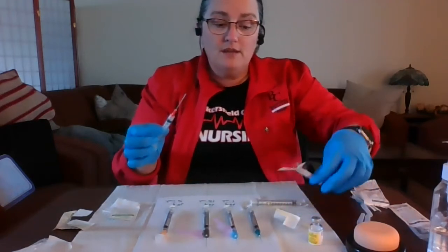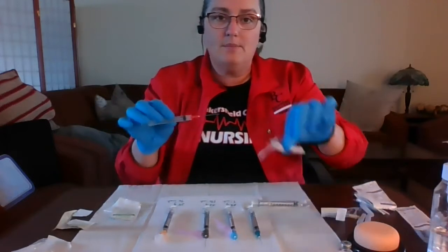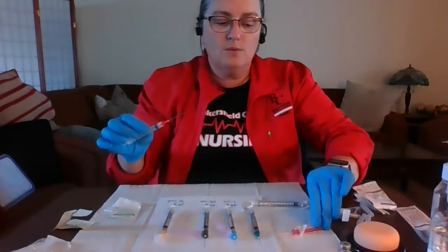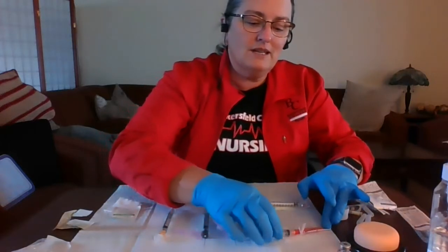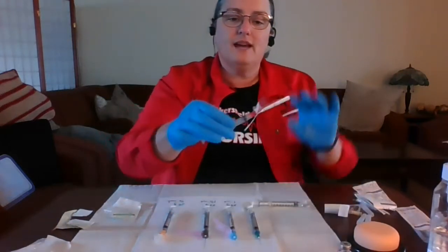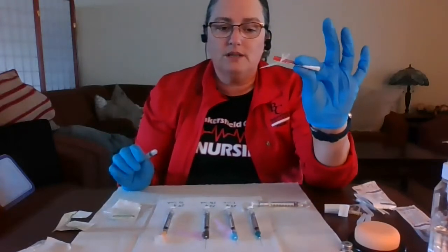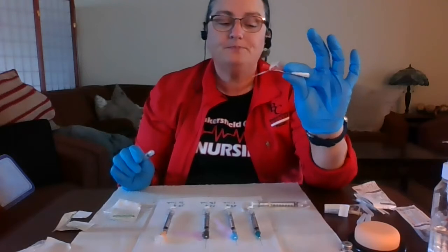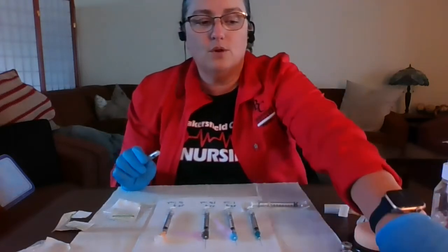Using the scoop method, practicing our needle safety, we never want to just recap a needle. It's too easy to poke yourself. And so using the scoop method, we can put our finger at the edge of the package and slowly insert until we feel that click, and then we can remove this. This can't be used multiple times. A draw needle should only be used one time each time that you breach this vial. So that would go over to the side.